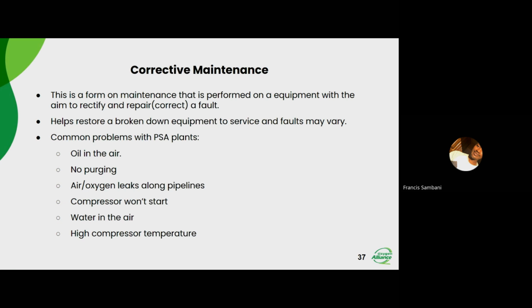And also maybe your oil scavenging pipe, because inside that same oil separator cartridge you have an oil scavenging pipe which scavenges the residue oils that are in the oil separator cartridge. If that one is blocked, that means you have oils inside your oil separator cartridge, so you might end up having more oil going to your PSA generator. So maybe you check the condition of those two and see if that helps solve the problem.